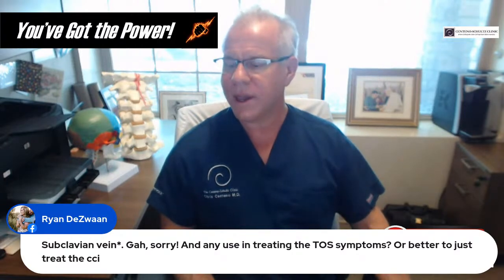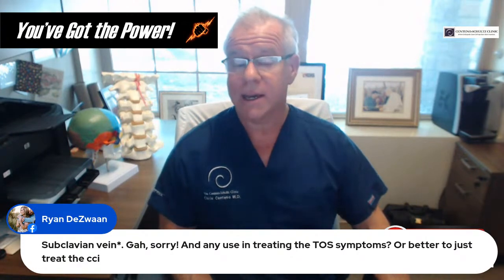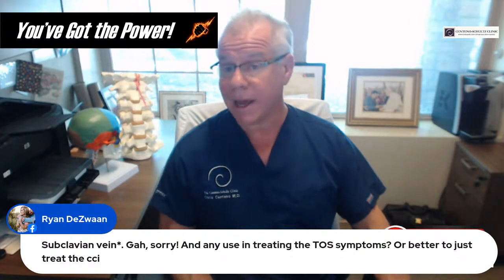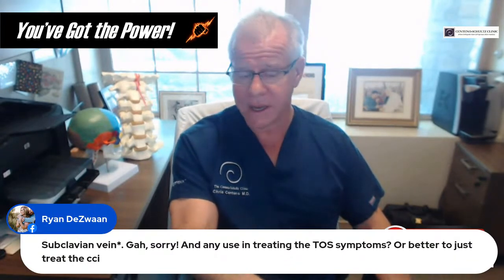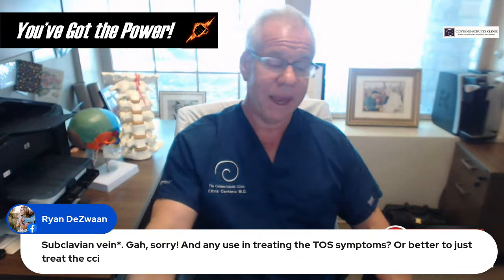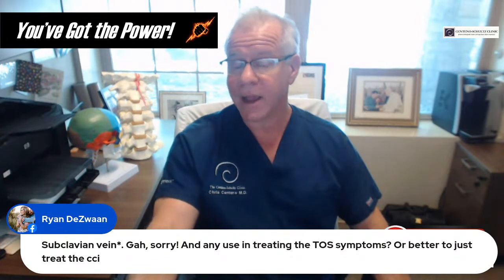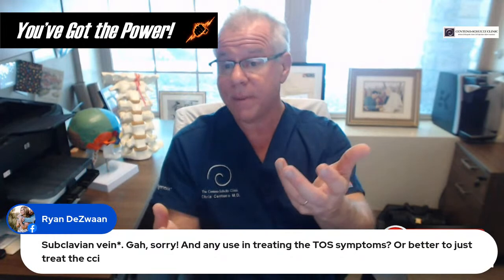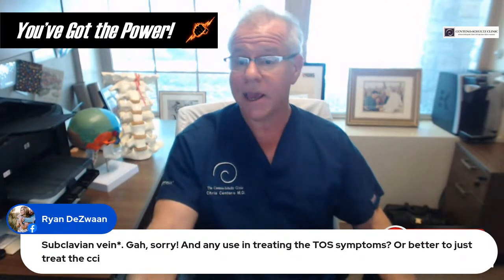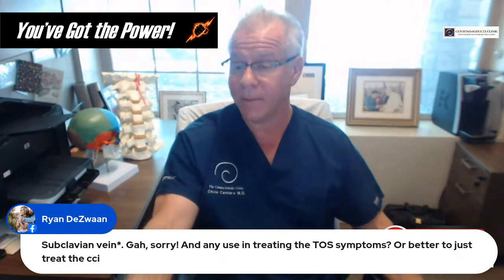So to start reviewing what we were talking about, here was this idea of diagnostic accuracy and making sure that these measurements that we get, whether they be clivo-axial angle, C1, C2 overhang on DMX, BAI, BDI, translational BAI, translational BDI, understanding what the diagnostic accuracy of those measurements really is. And the only way to determine that, as we talked about, is a blinded study that puts people into a symptomatic bucket and an asymptomatic bucket. And we have to find out what level of that number correctly classifies people into the right bucket.